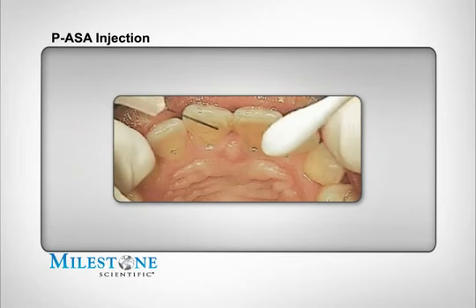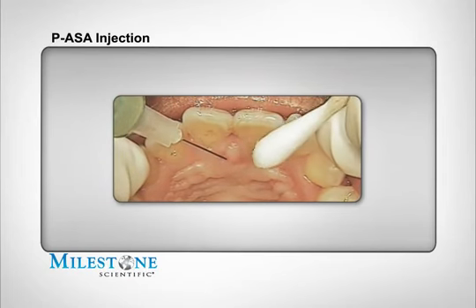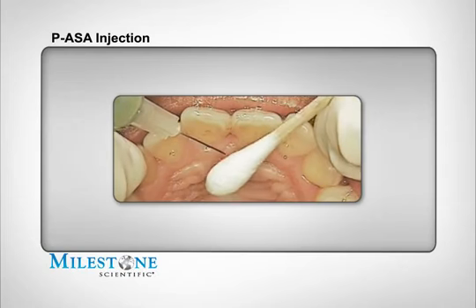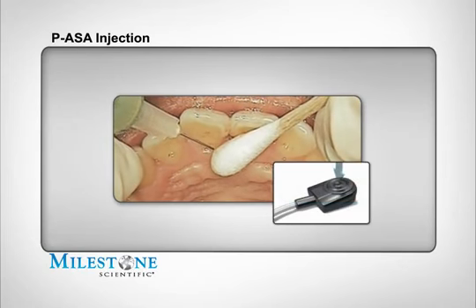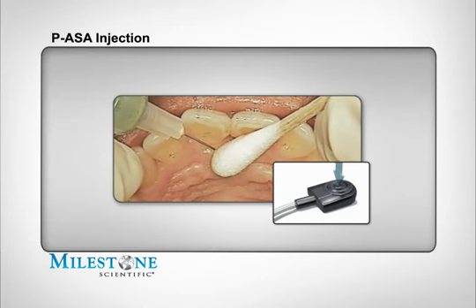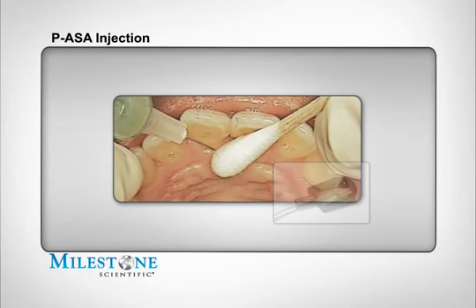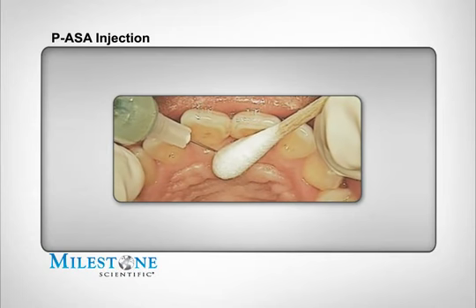We will now show a clinical example of the PASA injection being performed. You can see the needle is applied to the surface of the palate followed by the firm placement of a cotton applicator. The flow of anesthetic is begun by initiating the STA cruise control. Once the needle bevel enters the tissue, pause forward movement for an additional 4 to 5 beeps before advancing again.